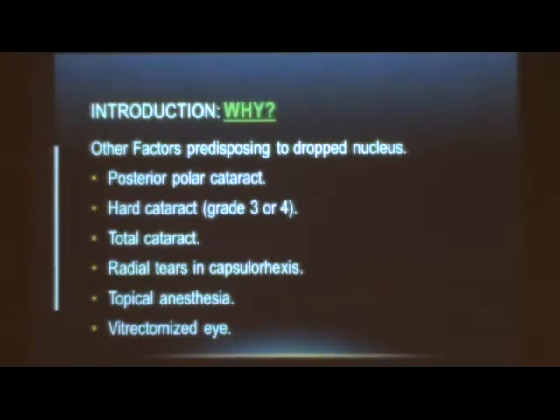Topical anesthesia. I would just want to stress on vitrectomized eyes. If you don't have enough experience, don't operate on fluid-filled eyes after vitrectomy, because once you go inside these eyes, the pressure goes down, and you may be faced with a hypotonous eye. So unless you have good experience with those, with cataract surgery, refer it to a more experienced surgeon.